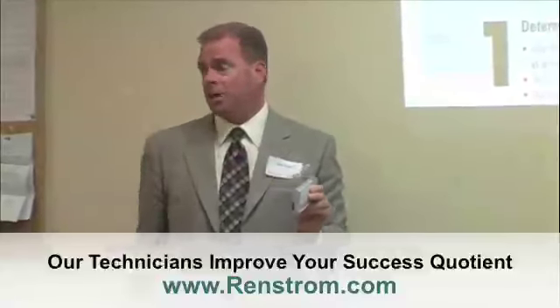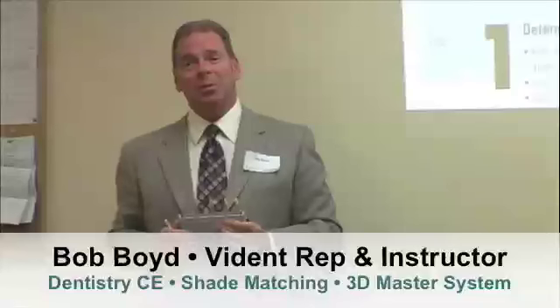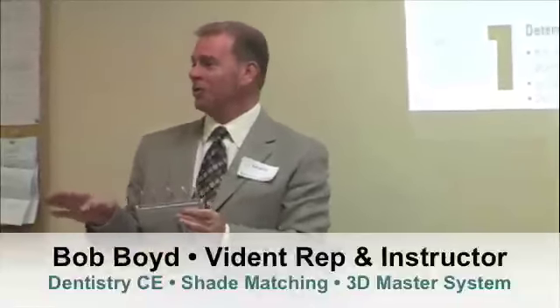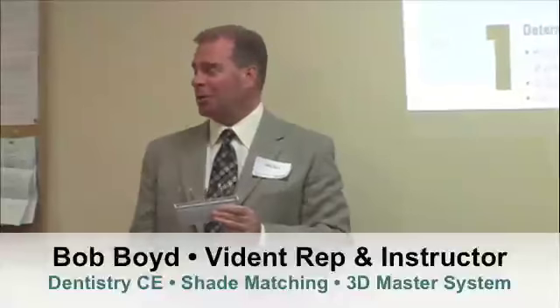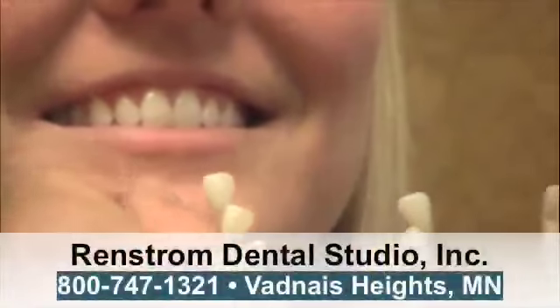The technicians at Randy's lab can make a 2.5. It's very easy. Our system is set up to support that. I'm really happy to say they use the Vita porcelain, so it's easy for them to mix it and make it. Not all laboratories can do that, so you're working with some pretty good folks here. They can turn out some fine work. So 2.5 is your value group. I think we're done with the classification.